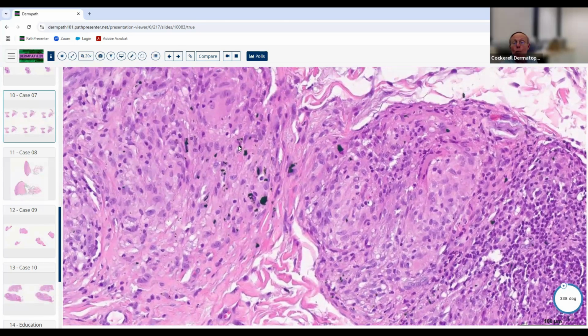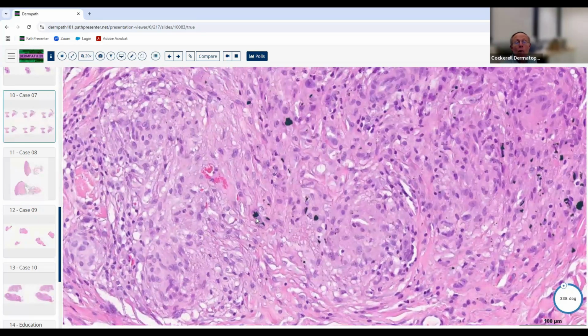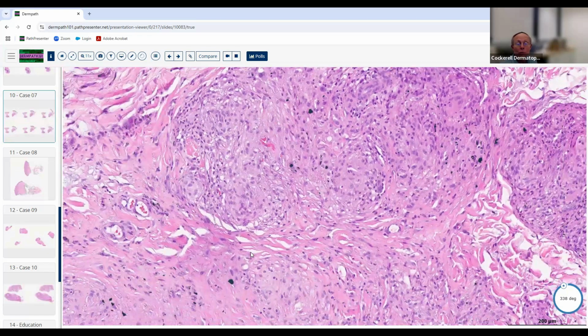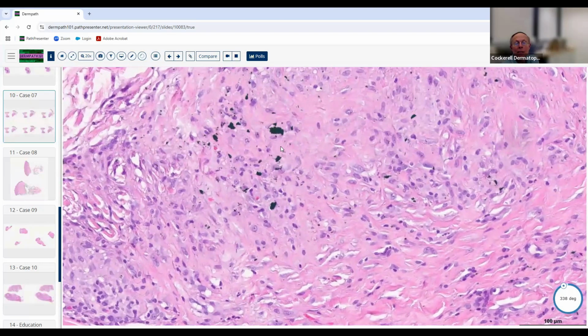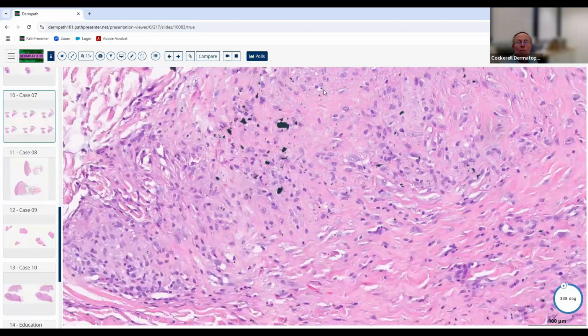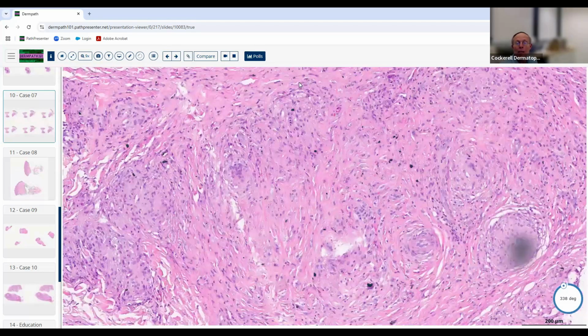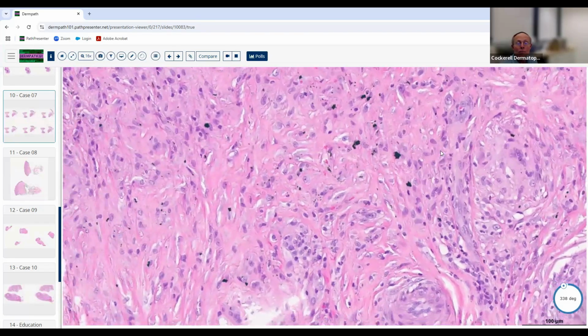It could be tattoo pigment. It could be something that was introduced by trauma. So patients that get into car wrecks and get soil in their skin, you see all sorts of material that can look blackish sometimes like this. This looks a lot like carbon. So you wonder if this person maybe had a non-professional tattoo. Maybe there was a prison tattoo or a gang tattoo or something like that, and they put the carbon in, and it wasn't pure ink like we see with tattoos from a tattoo parlor, for example, and maybe they got a secondary granulomatous reaction to this.